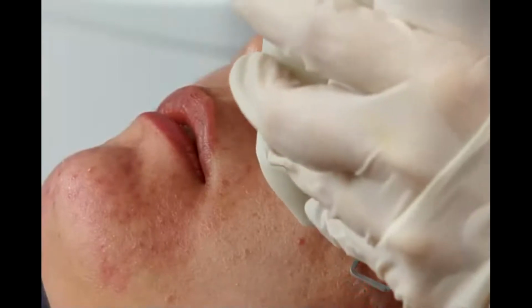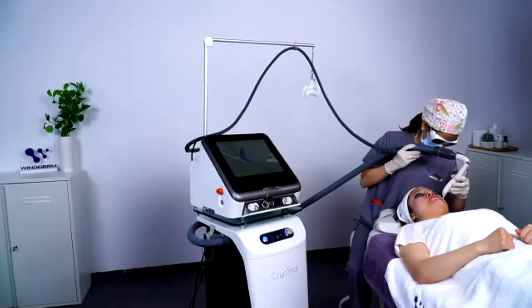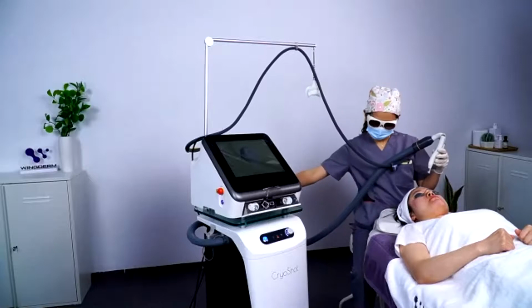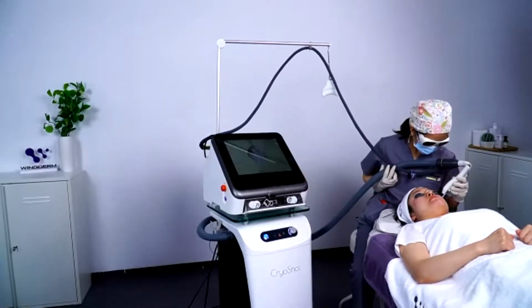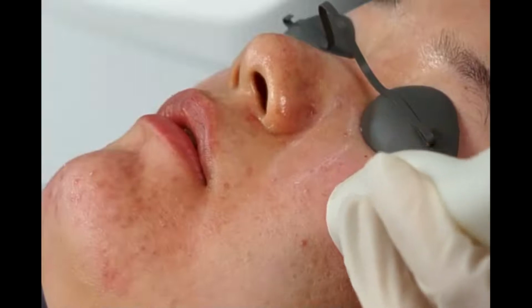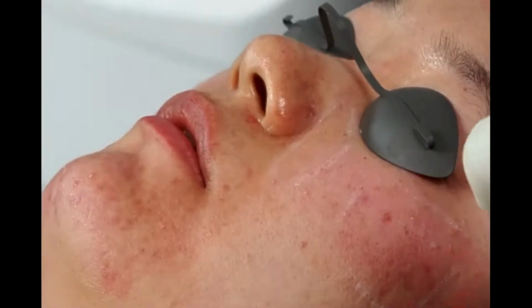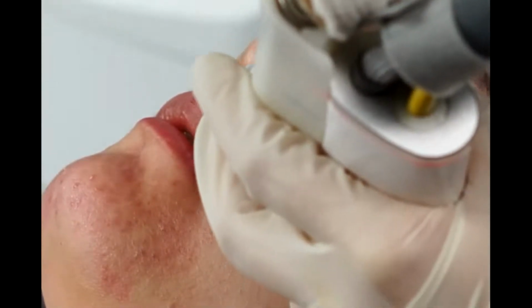For these 2 serious areas, we'll do 2 passes. We can see her skin has turned red and the pores have already raised.